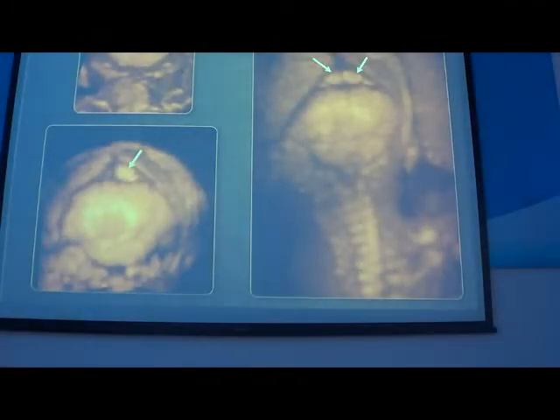This is a posterior view of the skull with a Vormian bone on the posterior fontanelle. And we can see it in approximately 6% of normal babies. This is a nasal bone. If you do the scan around 20-22 weeks of pregnancy, the size of the nasal bone is between 5 and 7 mm.